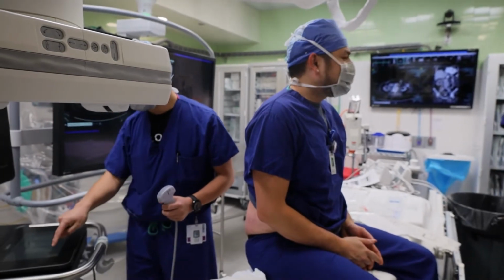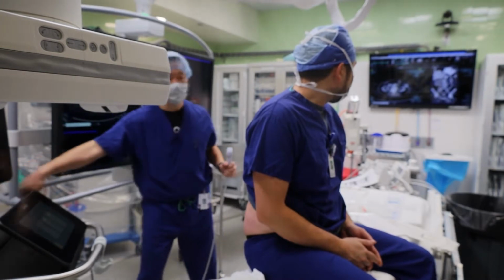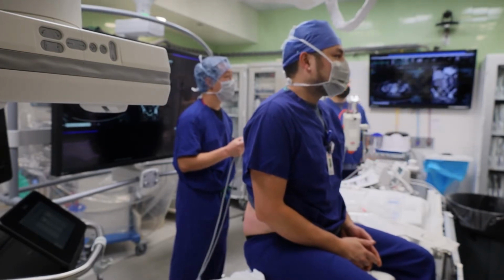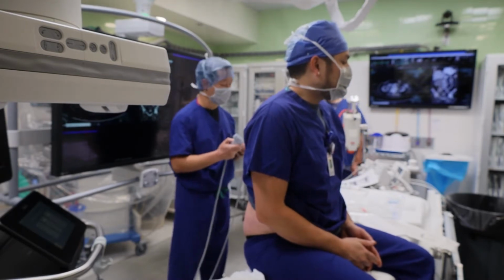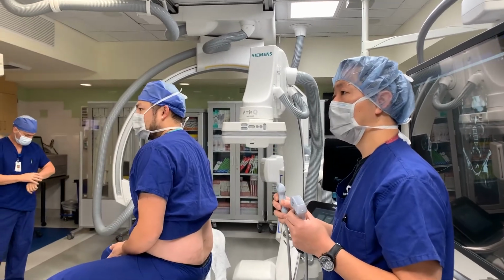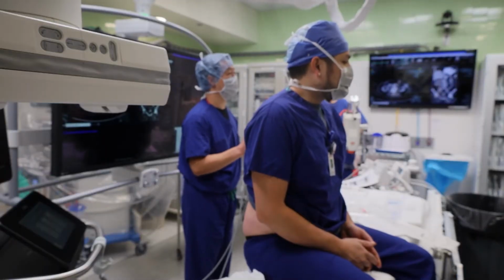So, standard ultrasound techniques. Did Dr. Shu talk about the difference between these two probes? What is the real difference between these two probes? Other than the shape, the depth of penetration. Do you guys know what's affecting the depth on these? The hertz. Right, so the megahertz on these is 6 to 13 megahertz and 2 to 5 megahertz. So lower frequencies penetrate deeper, higher frequencies don't penetrate as far.